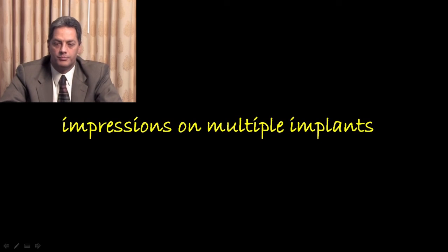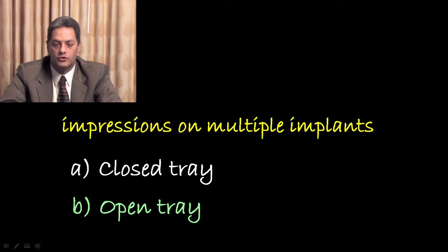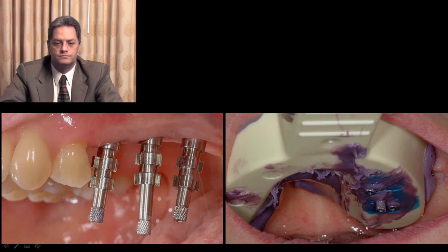Impression on multiple implants. It is my opinion, again, between the closed tray and the open tray, to use the open tray, even though the closed tray is the most common one. Especially when we're going to talk about multiple implants.